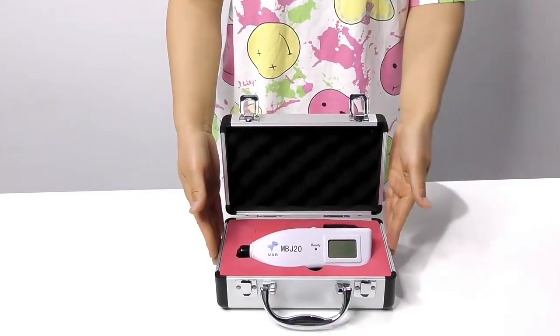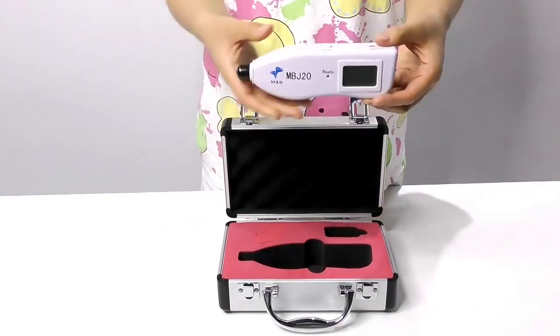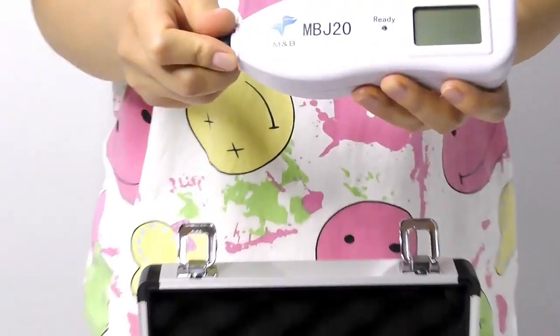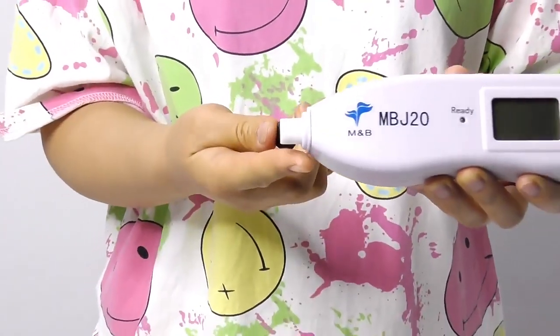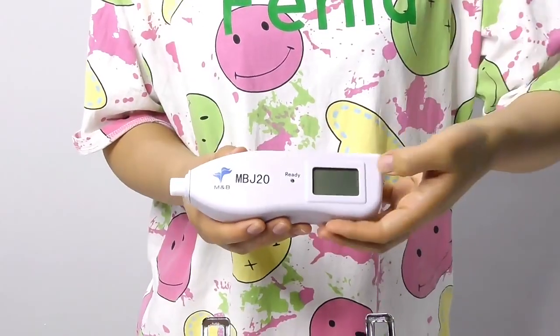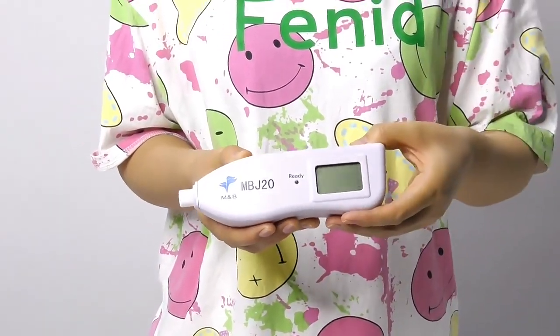Here is the equipment. There are two to three buttons for operation. This part is the test probe, and the screen is a 3-figure LCD screen.